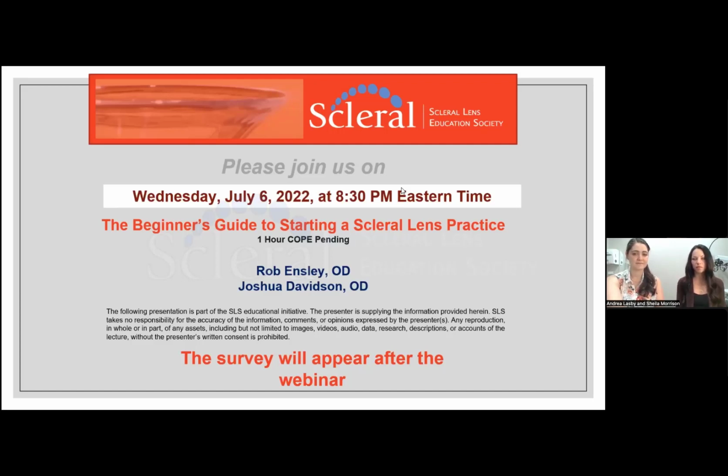Awesome. So another question we got was about putting the fluorescein dye, because someone mentioned that they heard that putting it on the very front of the lens is better to check for any leakage versus putting it on the bulbar conjunctiva. Have you tried or noticed any differences between the two? I have. I still like superior because in 95% of my patients, they're going to get it superior coming through. So it just gets the dye where it's needed faster. And I just see it faster because I'm right in the room and I don't have time.